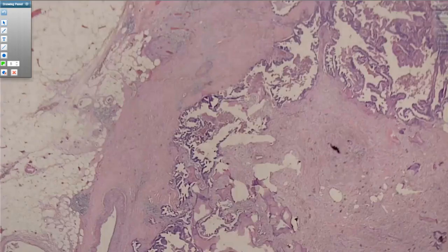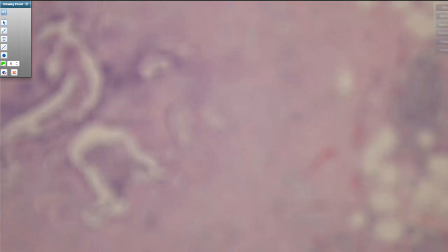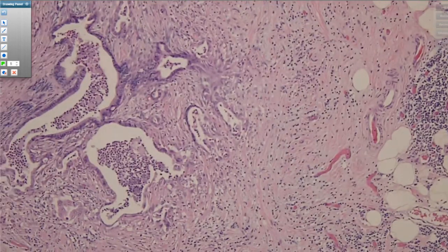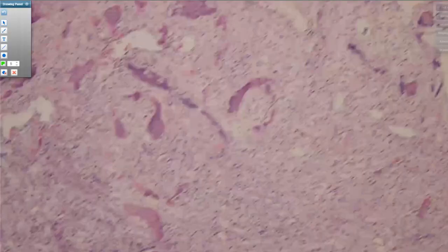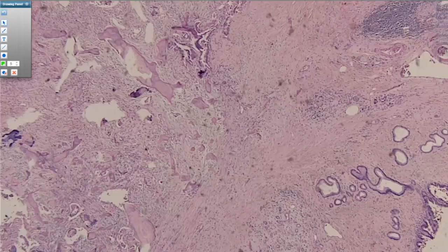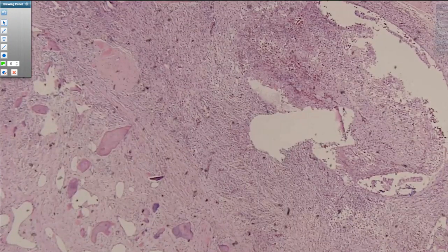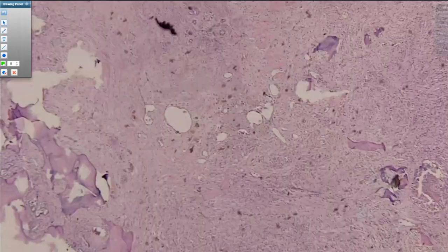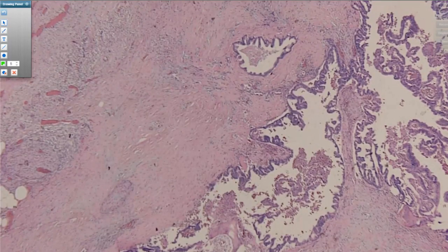All right, last slide on IPMN, just for fun, to show weird things that happen. So this was an IPMN that had a little bit of invasion associated with it there on the side, but it also was making bone in the middle. So you can see all sorts of funny things in these, because they'll sometimes have been sitting around for years in patients. Often, if they're not symptomatic, not obstructing or causing pancreatitis, until someone has an incidental scan for some other reason, they may not have ever known they're there.